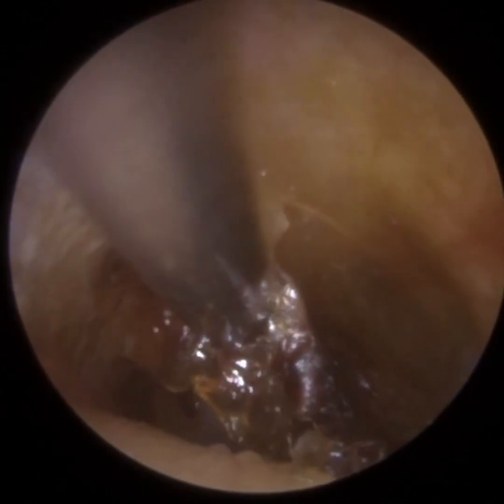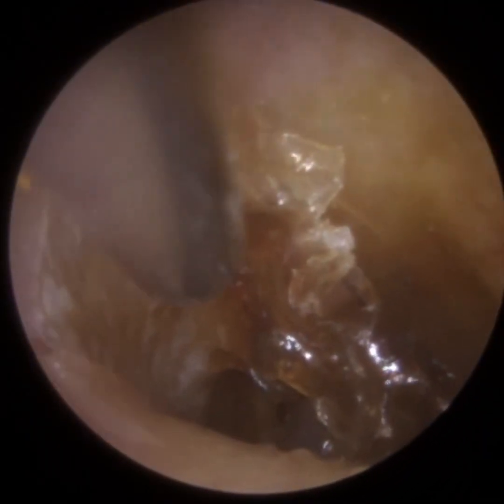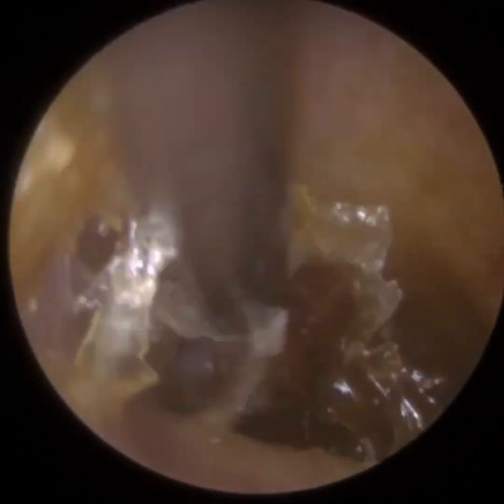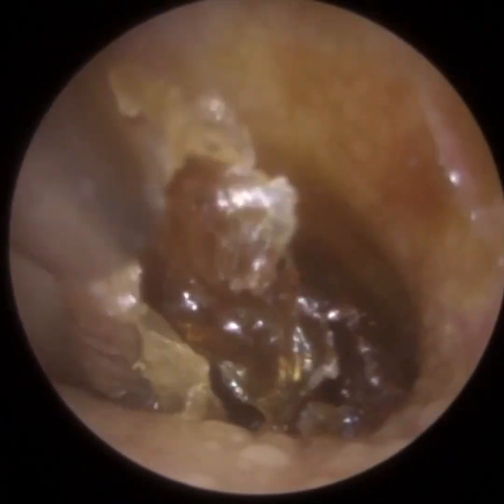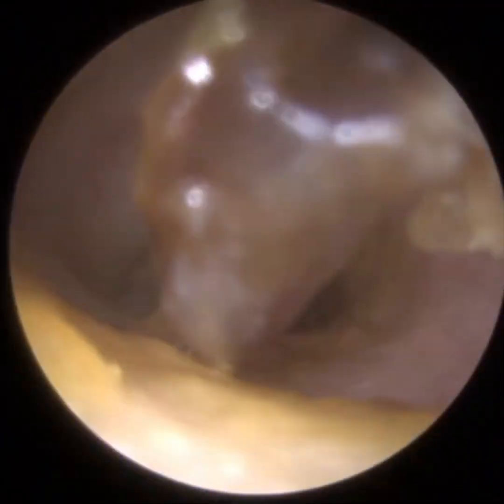The texture of this, the thickness of it, it is just a layer of dead skin that's died because of the infection. It's solidified. It's now formed a cast in the ear. It's not going to migrate on its own accord. So despite the infection being resolved, the patient's still struggling to hear because of this skin.